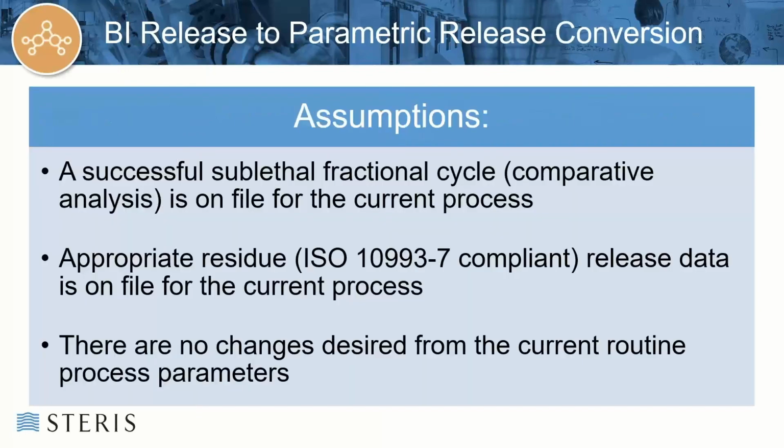The assumptions that you would make over here is a successful sublethal fractional cycle in a comparative analysis is on file for the current process. You've already qualified appropriate residue release data for your current cycle. And lastly, there are no changes desired from the current routine process parameters.